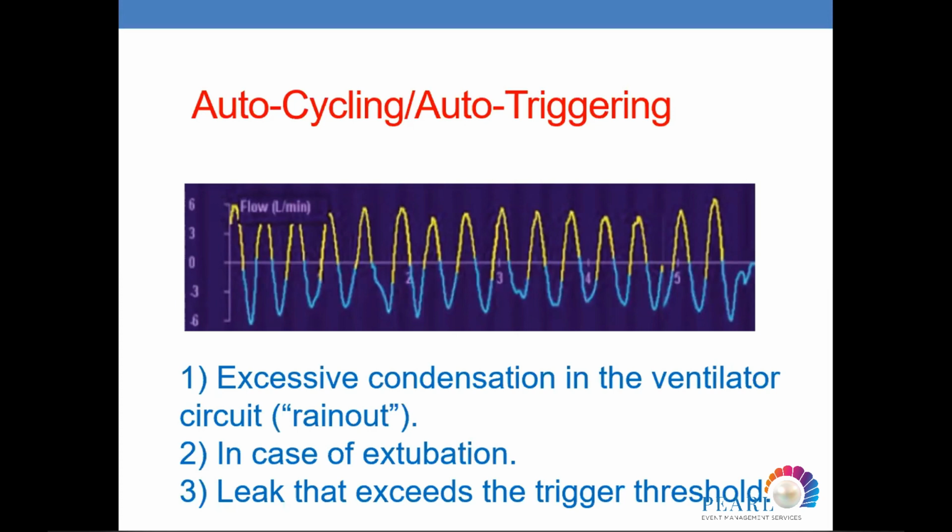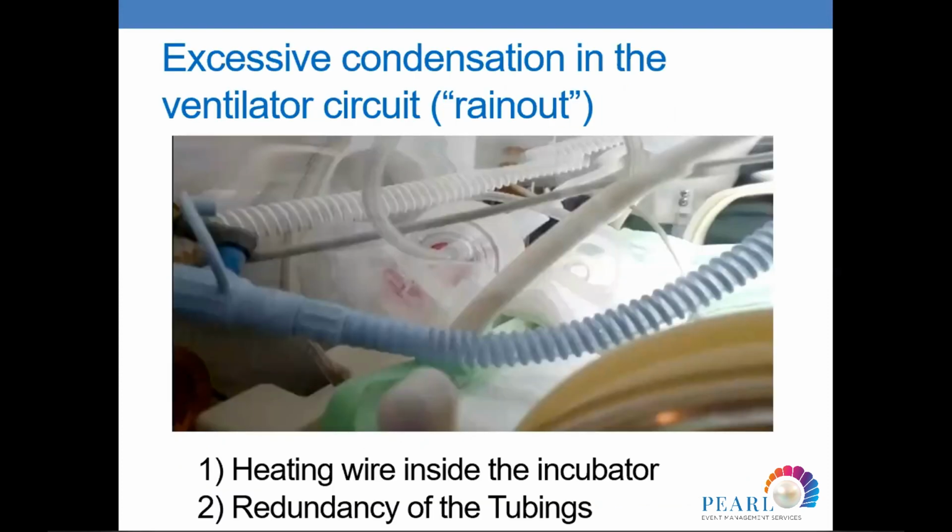So excessive condensation, or a leak as we mentioned before, or the baby is extubated, so the machine is just giving in air. Again, don't ignore the machine alarms.